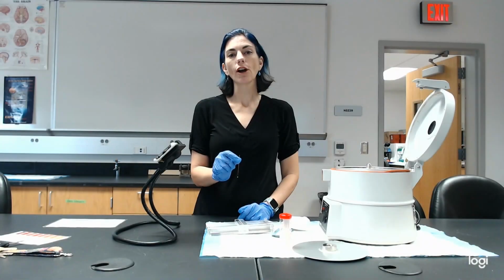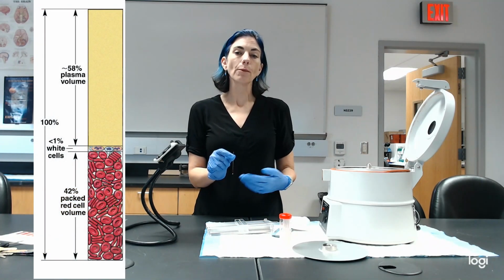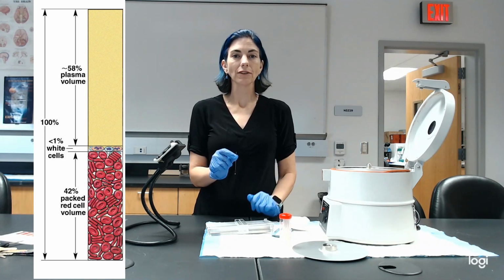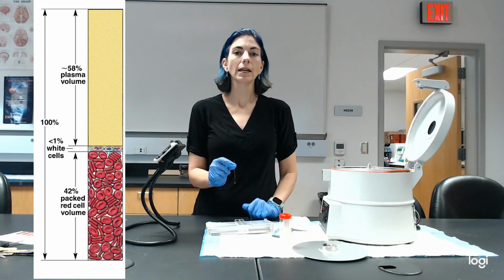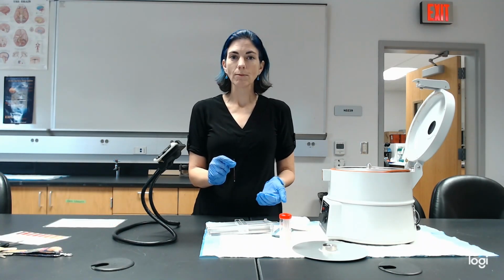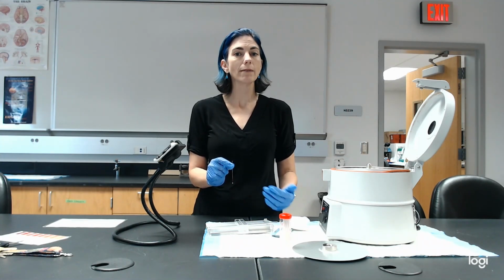Now hematocrits are read as percentages. So what it means is we're looking at the percentage of the total blood that represents the red blood cells. Now remember, the vast majority of your blood cells will be red blood cells. So even though all of the cells are going to be compressed at the bottom of this hematocrit, since almost all of those are going to be red blood cells, we can use that percentage as an approximation for red blood cells.